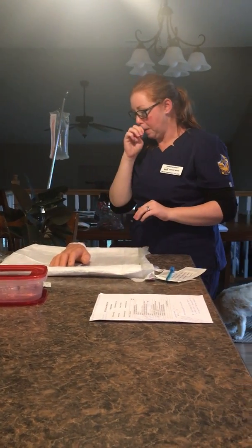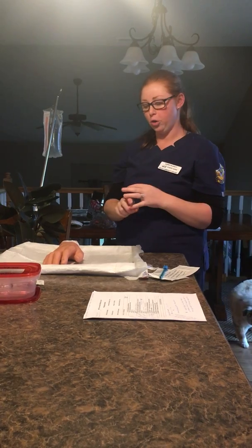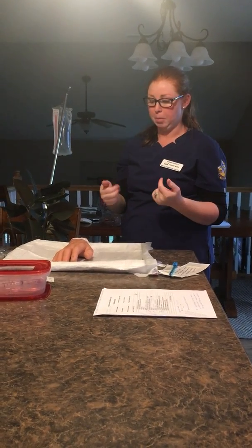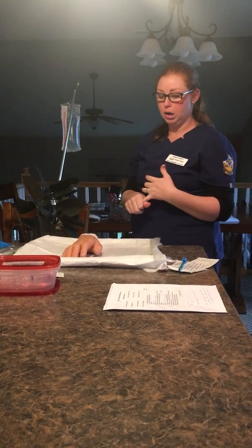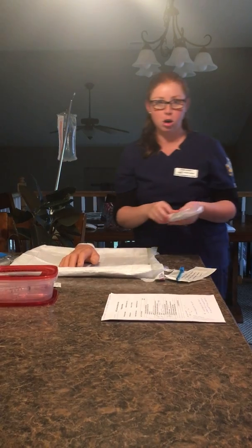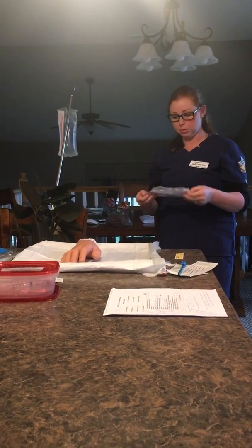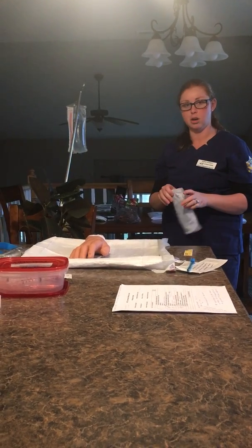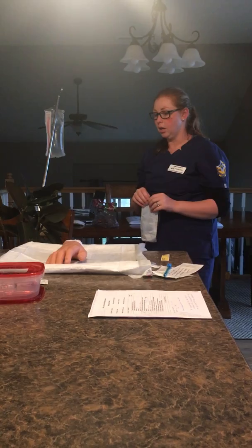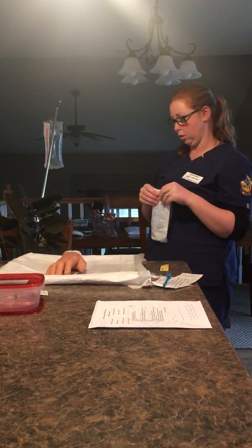So then I'm going to go ahead and make sure that I've identified my patient in the room. If she can identify herself, I can verify with her medical record number. But there needs to be 2 different methods of identification for her in order for that to be all right. So I'm going to explain my procedure to her, explain to her that we're going to go ahead and start an IV, tell her why, ask if she has any questions, and before I get too carried away here, make sure that all her questions are answered.